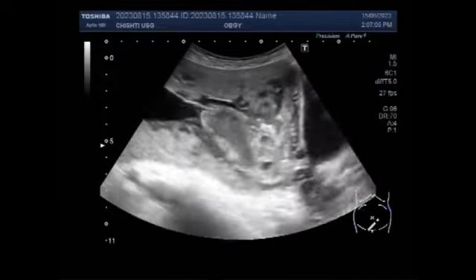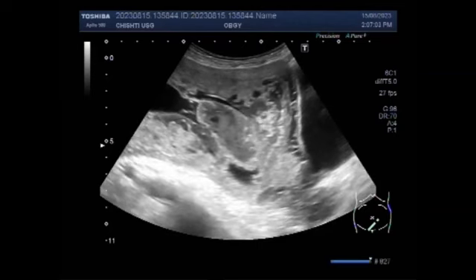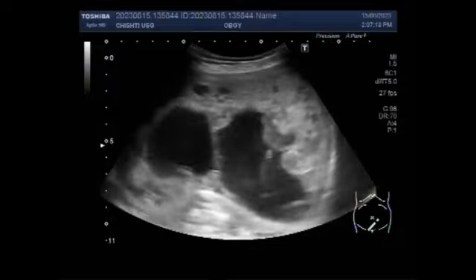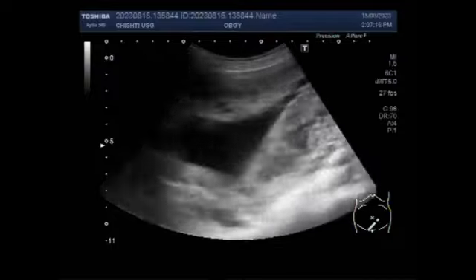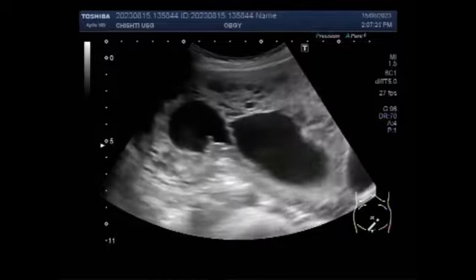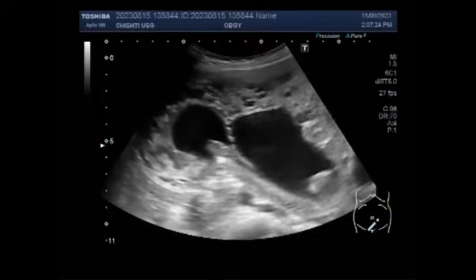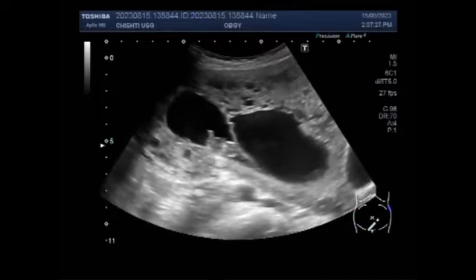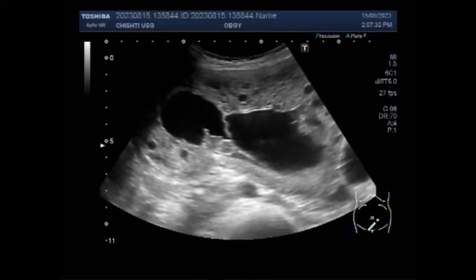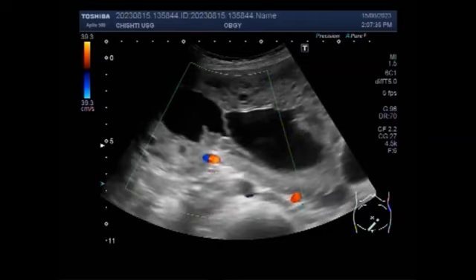MRI is essential to differentiate a twin pregnancy with the hydatidiform mole and a coexisting fetus from a placental mesenchymal dysplasia because the perinatal prognosis is favorable in the latter. Now again you can see two gestation sacs having fetuses in their interior with fetal demise.